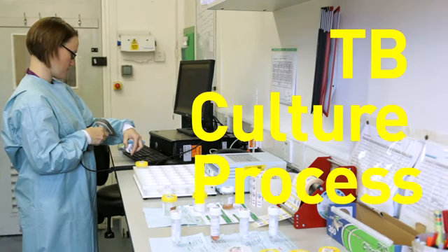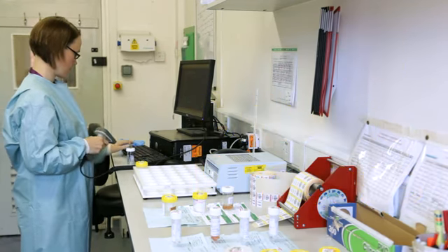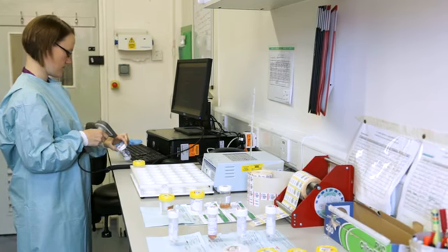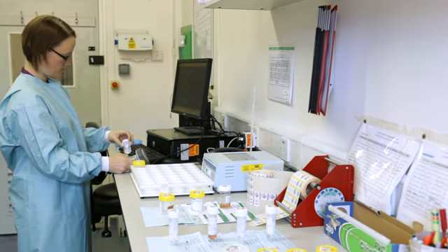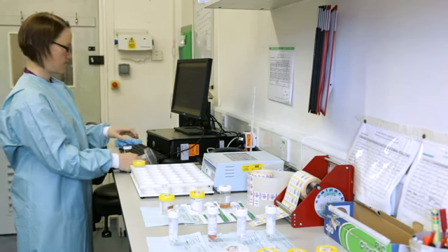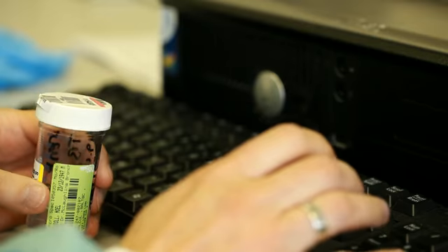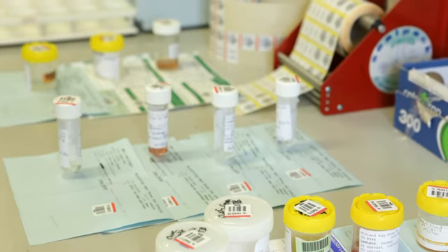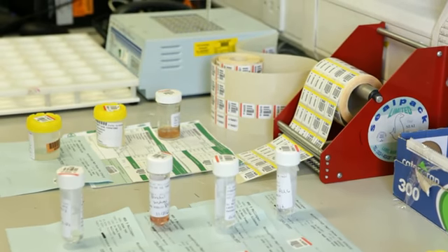The specimen is one of the most important factors affecting laboratory diagnosis of mycobacterial infection. A good laboratory report is dependent on receiving a good quality specimen. Initially in the laboratory, all specimens are evaluated, labelled and entered into the laboratory computer system. Any inappropriate specimens are rejected and reported as such. A maximum of 30 specimens are processed each day in the IMRL.